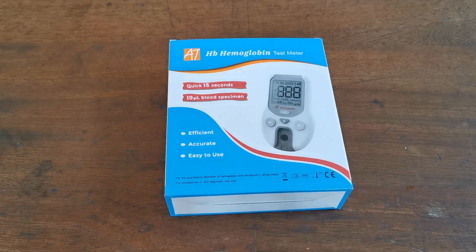Welcome to this ValueMed product demonstration for the AllTest Haemoglobin Meter.